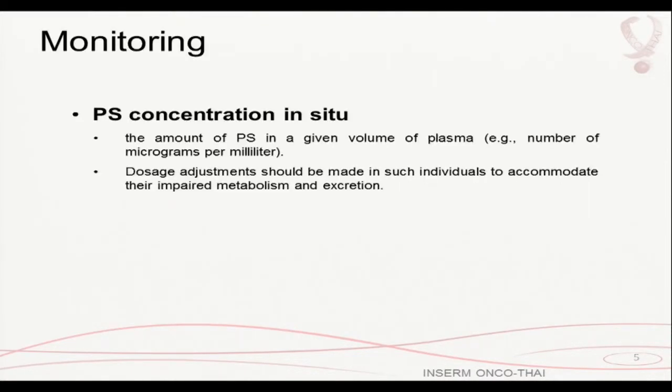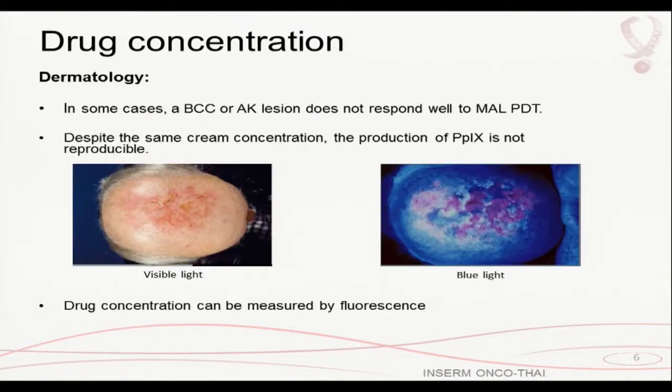So, monitoring. If you want to know the photosensitizer concentration in situ, in order to adjust the dose, maybe to adapt the amount of light, that's not dosimetry, that's monitoring. And that could be very useful to know the drug concentration.